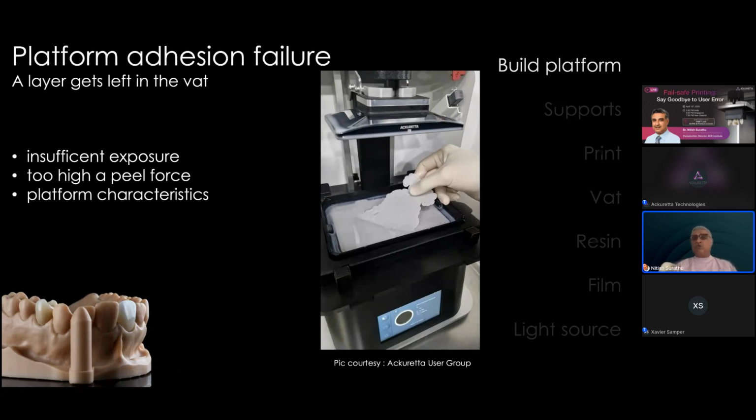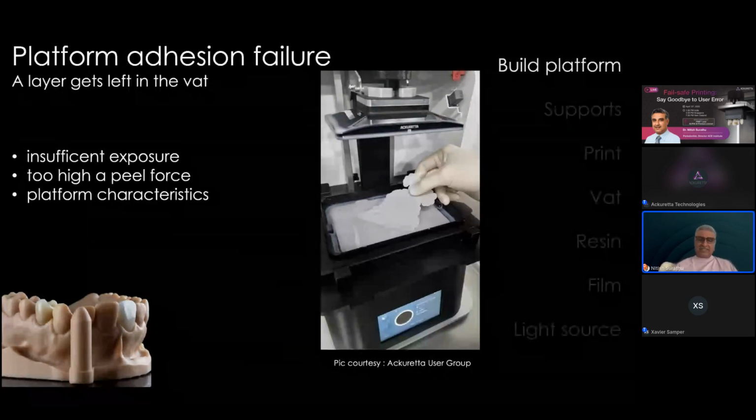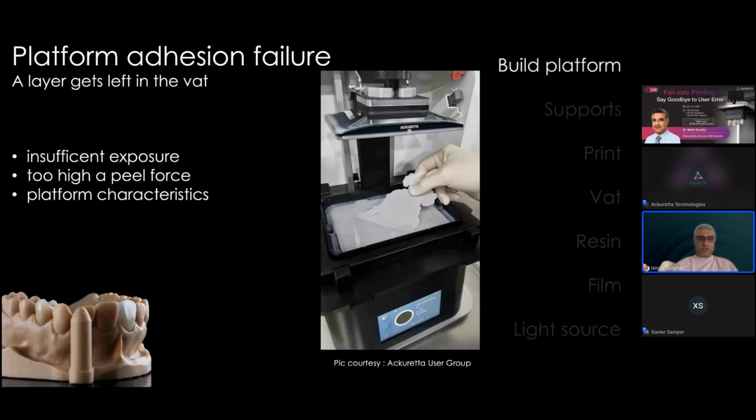That is something you should never do, because you run a high risk of leaving behind particulate debris that can break off from that layer. If you have a layer like that, I will show you at the end of this presentation how you clean a vat, and that's the right way to do it, of course. If you're working with a transparent resin, sometimes it may be possible to do this, but even then I would discourage that, especially for a novice user.